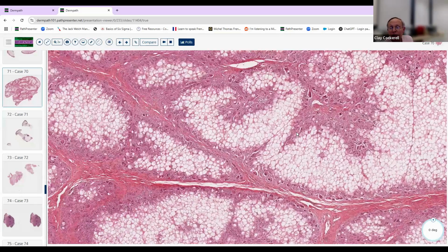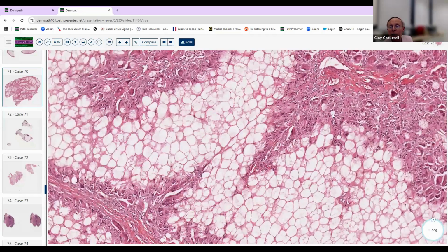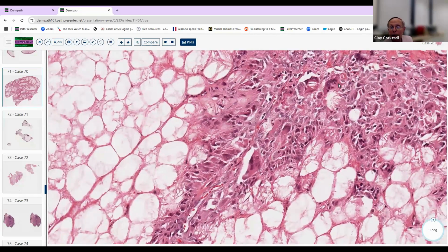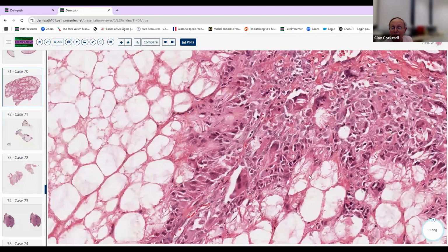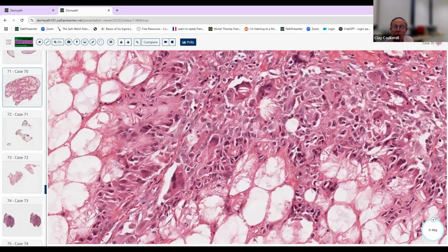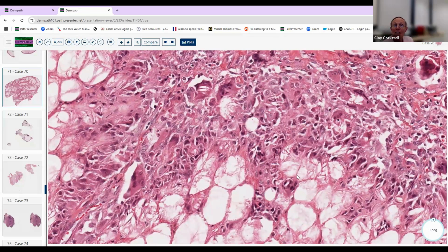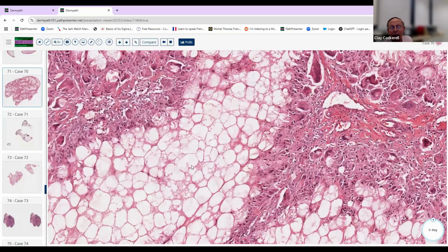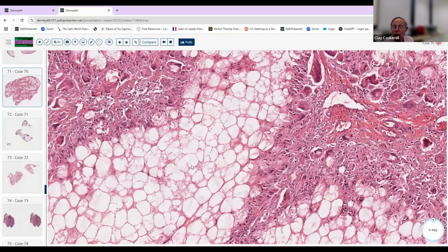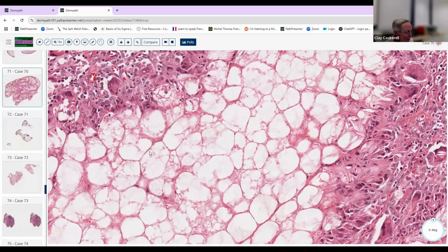And they've got all this inflammation, this is granulomatous inflammation with these crystals. This is subcutaneous fat necrosis of the newborn. You've got to recognize these are crystals in the fat. They have higher levels of palmitic acid in their fat when they have this abnormality than other children do. And it just kind of precipitates out and they get this granulomatous inflammation with crystals. So this is one of the crystalline panniculitides. Classic example of that.